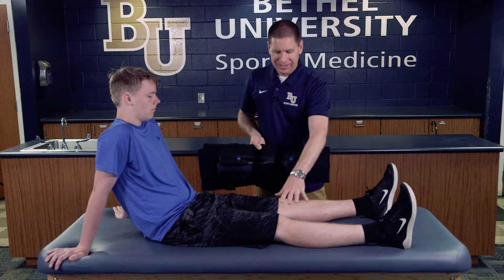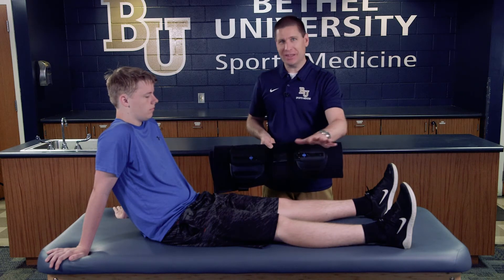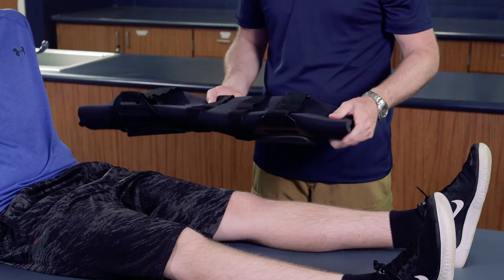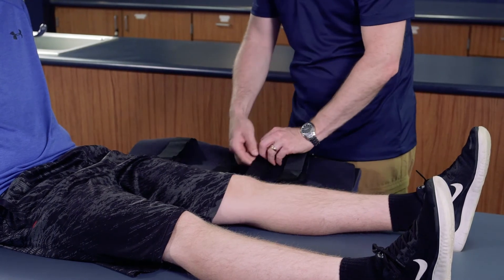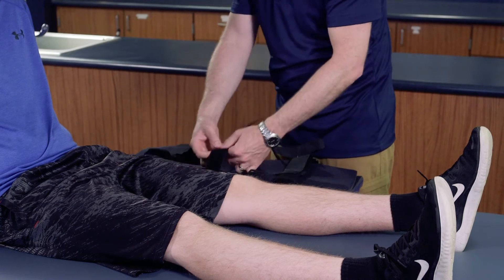Our injured athlete has an injured knee, so we want to make sure that he isn't able to flex or extend his leg. This is going to fully immobilize his leg. The first thing we want to do is open up all of the straps so we can place the knee immobilizer underneath his leg.